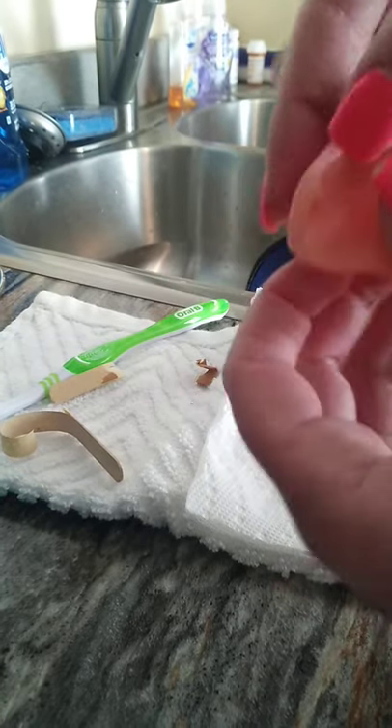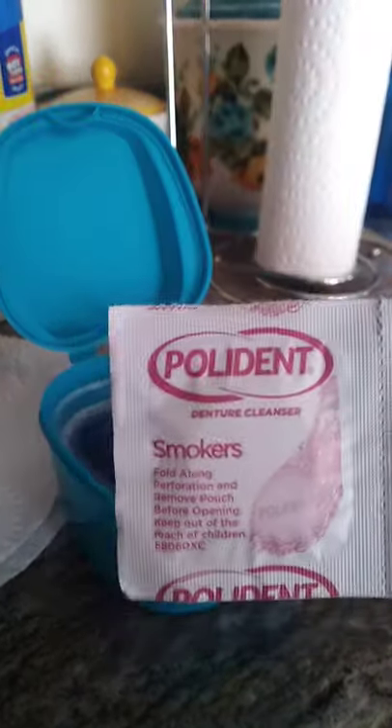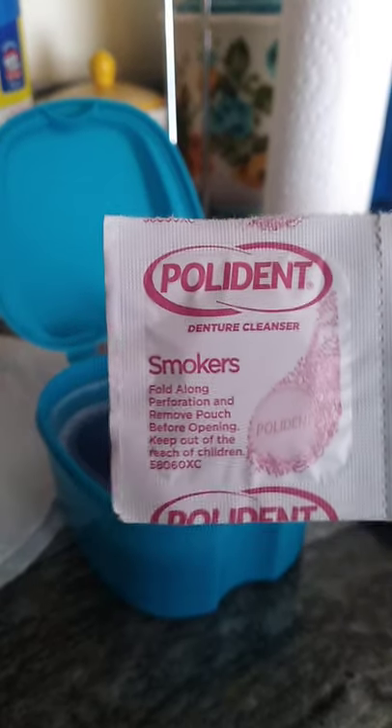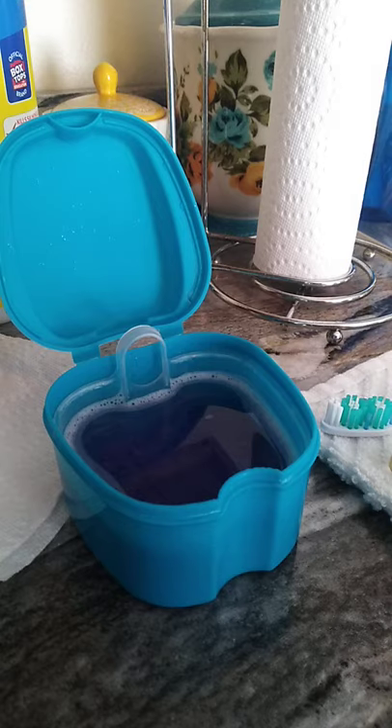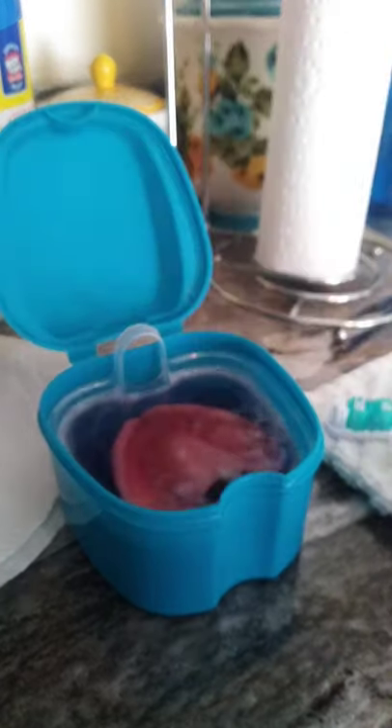I did soak my denture, but I am going to do it again given I put germy stuff on it. So of course I'm using my Polydent Smokers Edition, which is cool and it's purple. Not to be a girl or anything, but you know, I'm going to be. So I'm going to put it back in there and soak it.